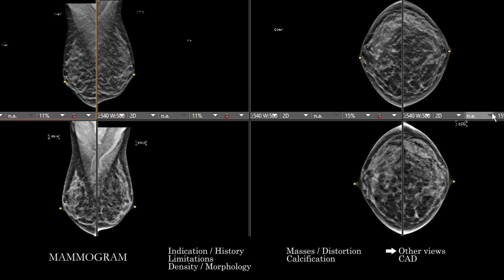At the end, if there are special views such as a true lateral, an exaggerated CC view, rolled views, or cleavage views, you want to use a similar approach covering the entirety of the anatomy to look for abnormality on those views as well. Those are more commonly used in diagnostic mammograms than in screening mammograms, and you apply a similar approach to make sure you cover all the potential anatomy.